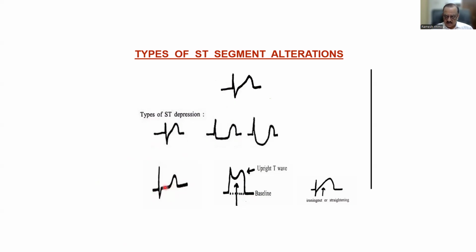So, in any ST segment, there should be an imperceptible merger of the S wave and the T wave, gentle concavity up, not horizontally staying in the midline for more than 3 or 4 small squares. If any of those things are there, it is an acute event. It is an emergency. Something has happened just now. That's what we mean by acute. And this fellow needs to be admitted, observed, serial ECG taken, all preventive measures taken to treat him for acute myocardial infarction. Everybody got it?